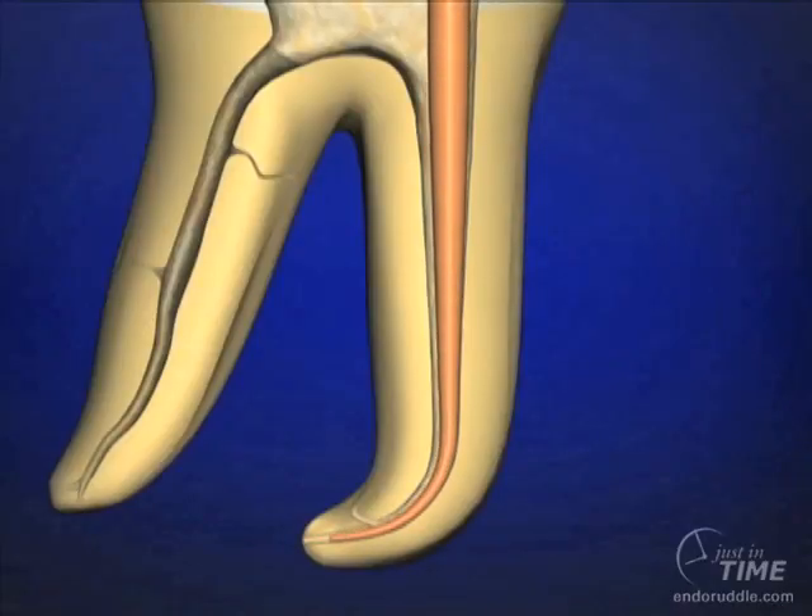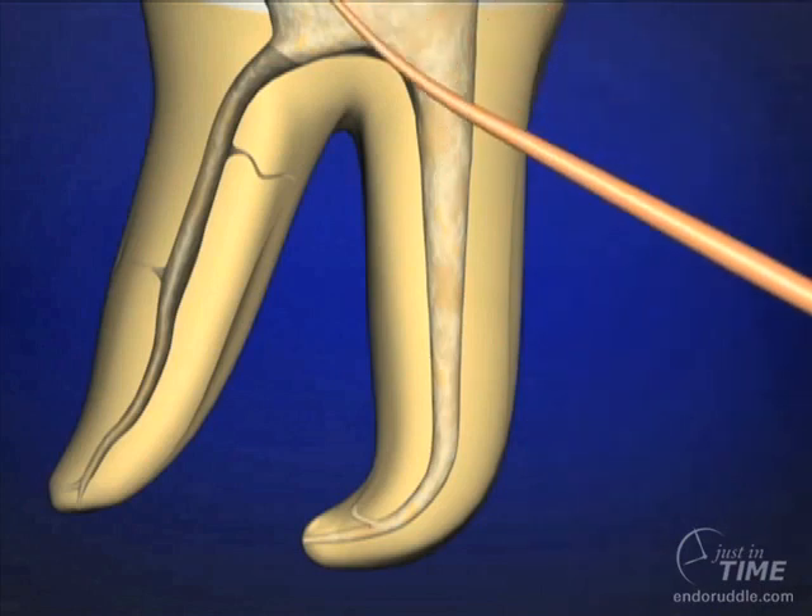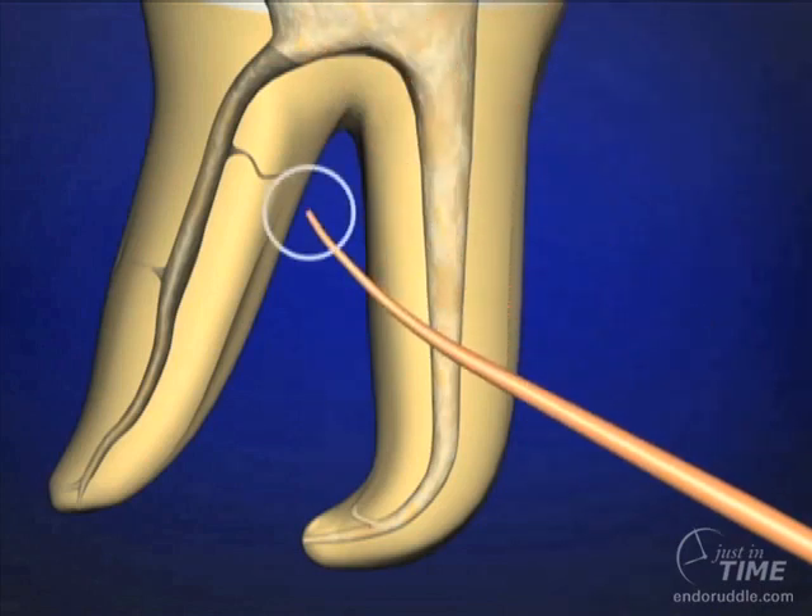Every time that cone rubs into dentin, it'll leave a little mark. If we take the cone out and look at the tip, that's where we should see the rub marks or indentations — this means we have apical tugback. The cone is smooth and shiny over its length, meaning it's free and not contacting dentinal walls in a tugback position.